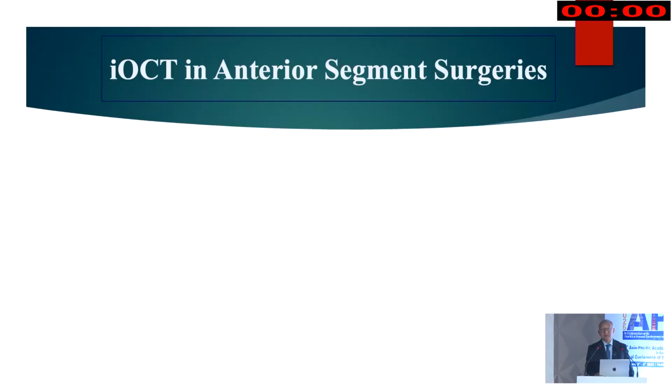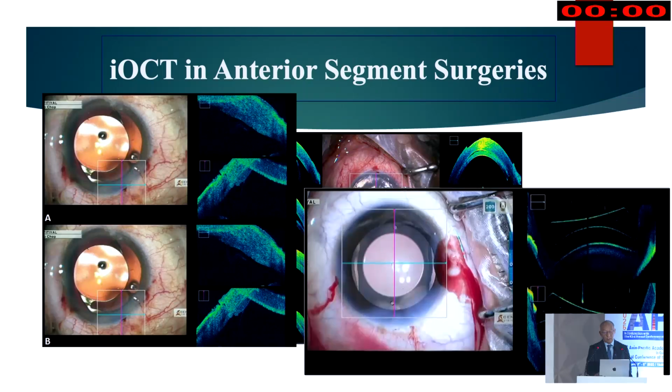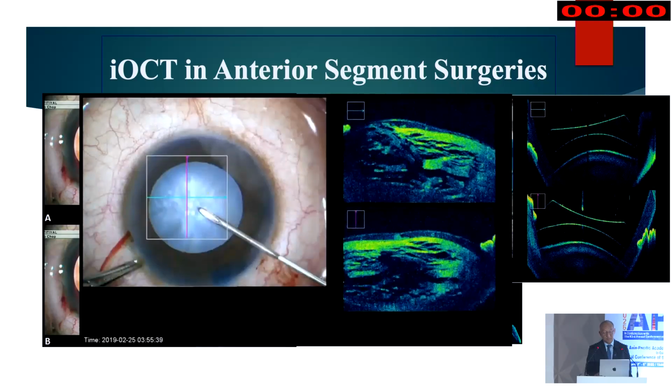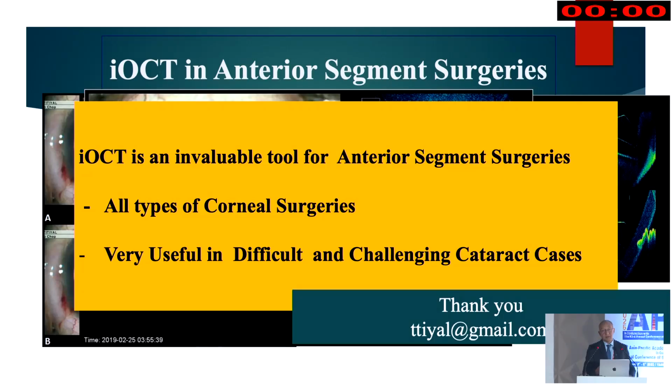So I can summarize this. Please don't think that I am just showing the intraoperative OCT microscope. Replicate that image to OCT, anterior segment OCT imaging. Replicate that to your slit-lamp examination. You'll do better in your surgeries. It is very useful in corneal surgeries, useful in assessing the wound areas, useful in refractive surgery like SMILE, lenticule-based surgeries, as well as ICLs also. Cataract surgery, yes, it is very, very definitely advantageous to image your cases before surgery, intraoperatively, and postoperatively also, and change your concept.